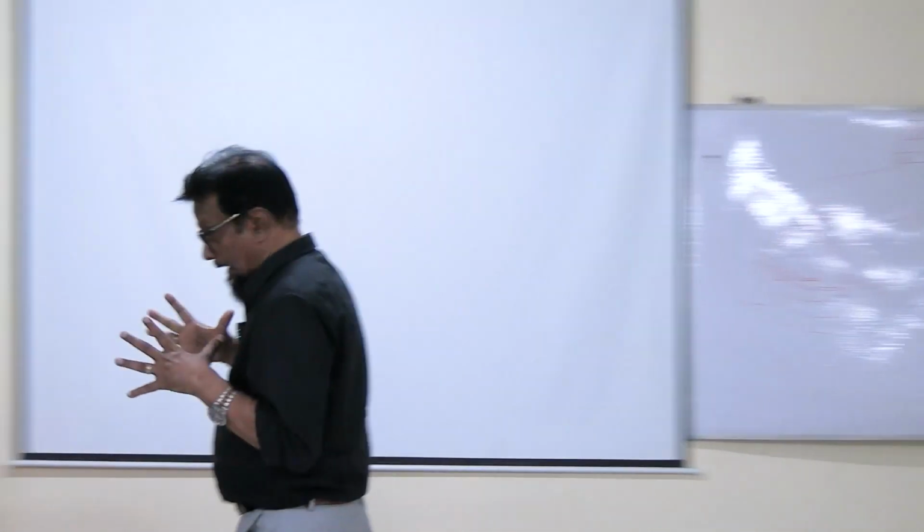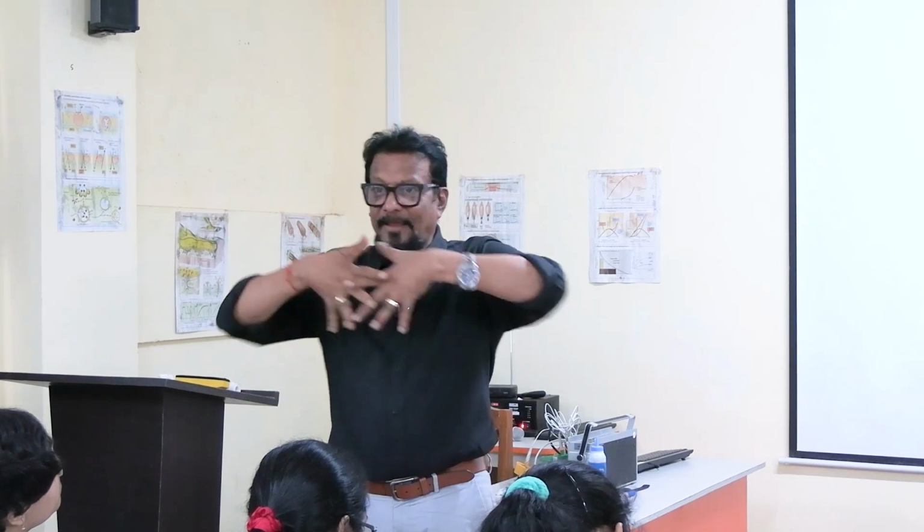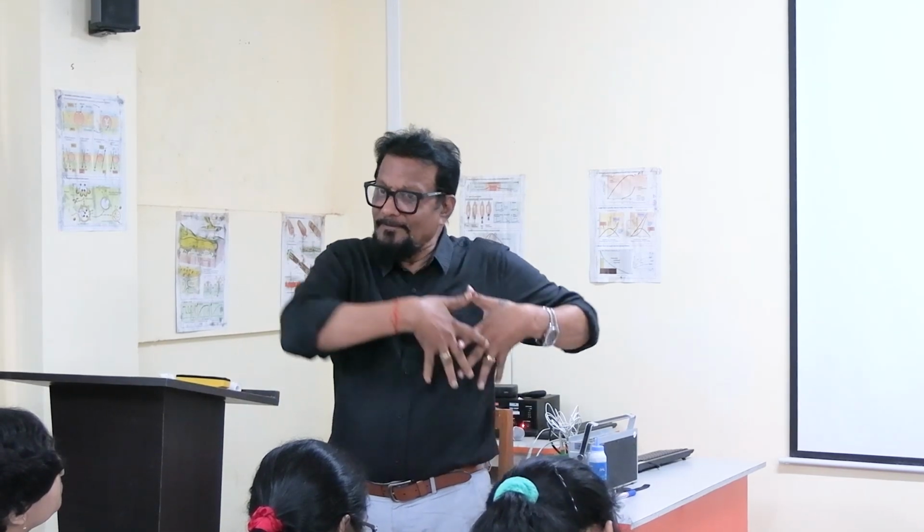So this is the exploring electrode, and the other one is the fixed, reference or indifferent electrode. Now where to place the exploring electrode? Because I have to see the heart anteriorly, laterally, posteriorly, and see what is happening in the septum. That's why I have to see the heart from different sides.